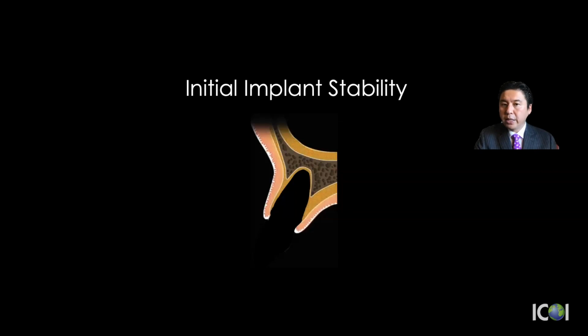In the aesthetic zone, in order to get initial implant stability, you always start the drill in the palatal bone. Sometimes you have a straight-shaped drill, okay, and make the osteotomy in the palatal bone. It's really hard, but you make the first drill in the palatal bone, and then when you take a tapered design, you make the osteotomy like this. They're like a latch design, okay? But you always see that when you place the implant into the socket, you undersize the osteotomy, your implant is fatter than the osteotomy.